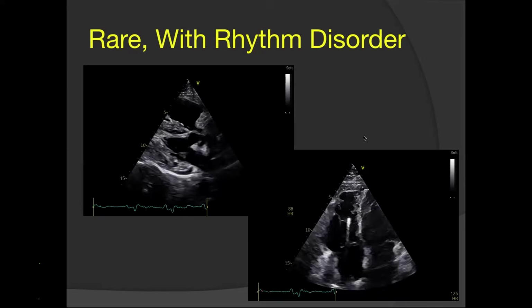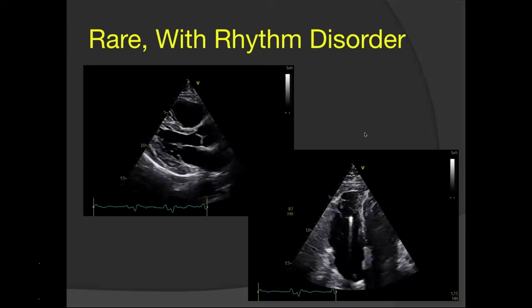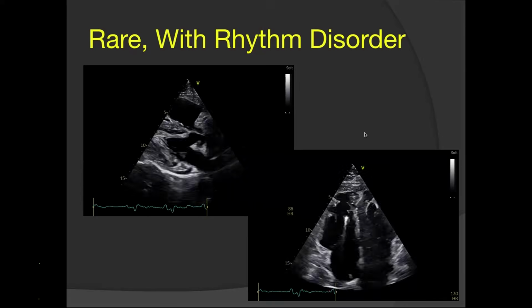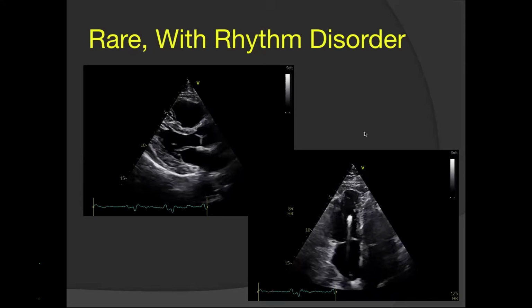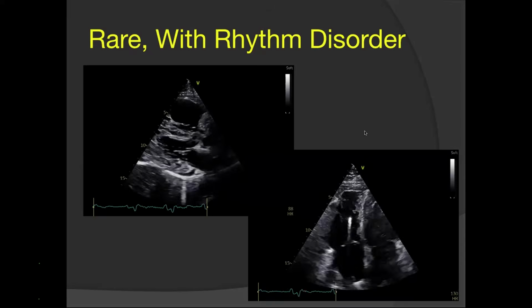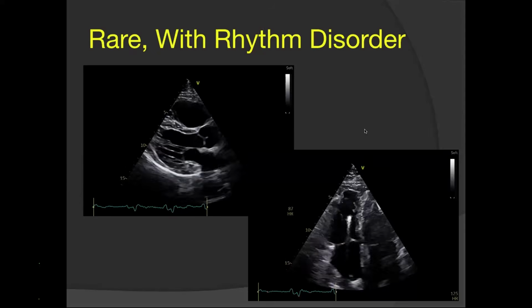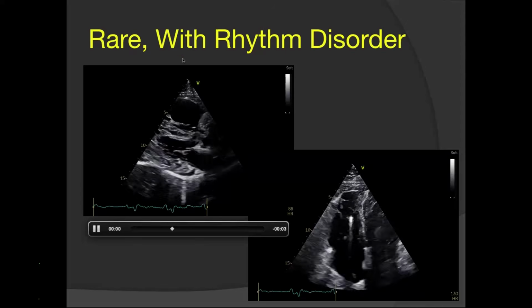So, emphasizing that we should always look at the history. I know the patient has been referred by an electrophysiologist, the patient has an ICD in place. Still, if I look at the ejection fraction, 50-55%, report and forget about it, I would be making a grave mistake. Once I thought about a young patient receiving an ICD coming from an electrophysiologist for an echo, I suspected dilated cardiomyopathy, of course, but also thought of this rare rhythm disorder.